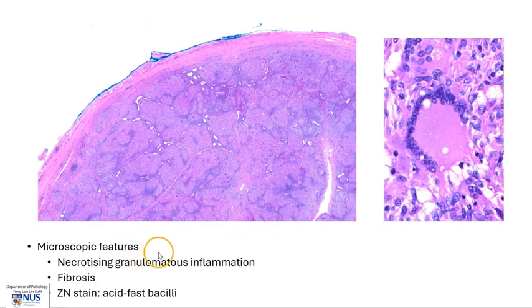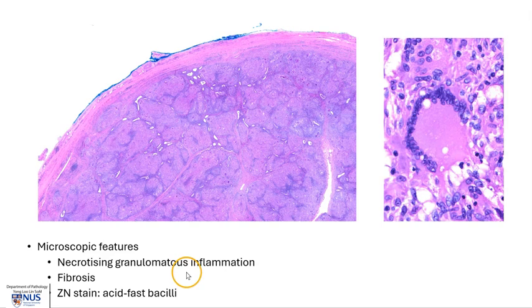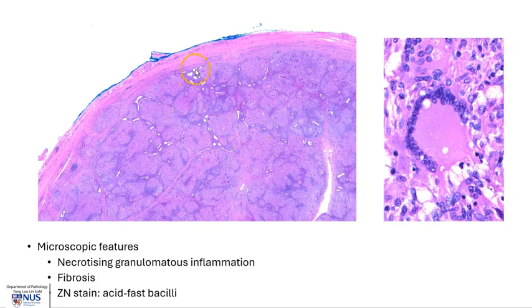Microscopically, there is necrotizing granulomatous inflammation and sometimes also accompanying fibrosis. The Ziehl-Neelsen stain would reveal the presence of acid-fast bacilli. Here we can see the epididymis, which is mostly replaced by these rounded structures representing epithelioid granulomas, with still a little bit of residual viable epididymal parenchyma in between.